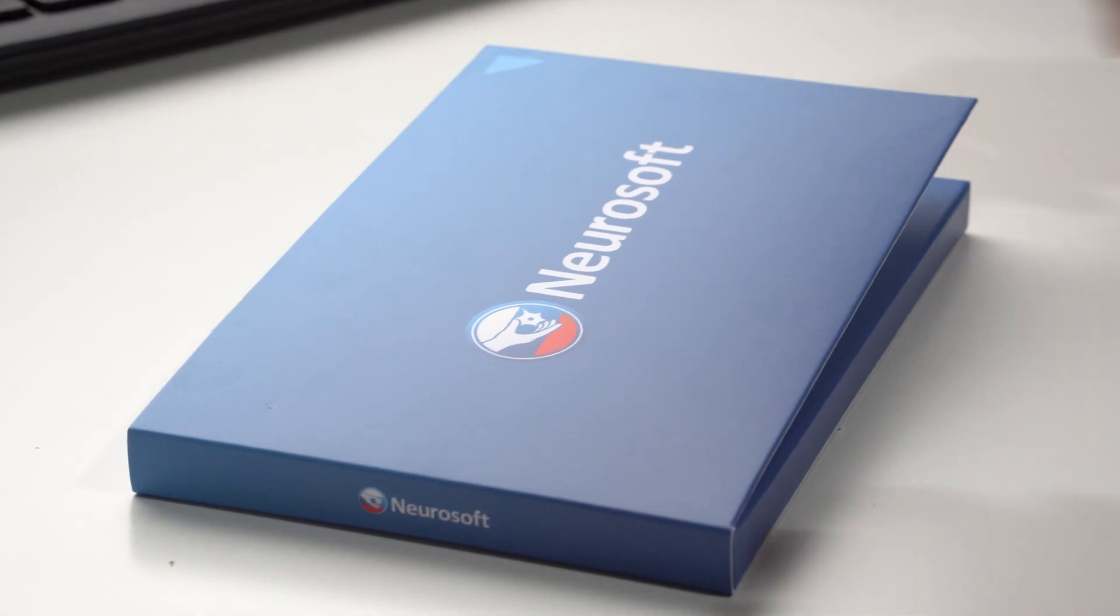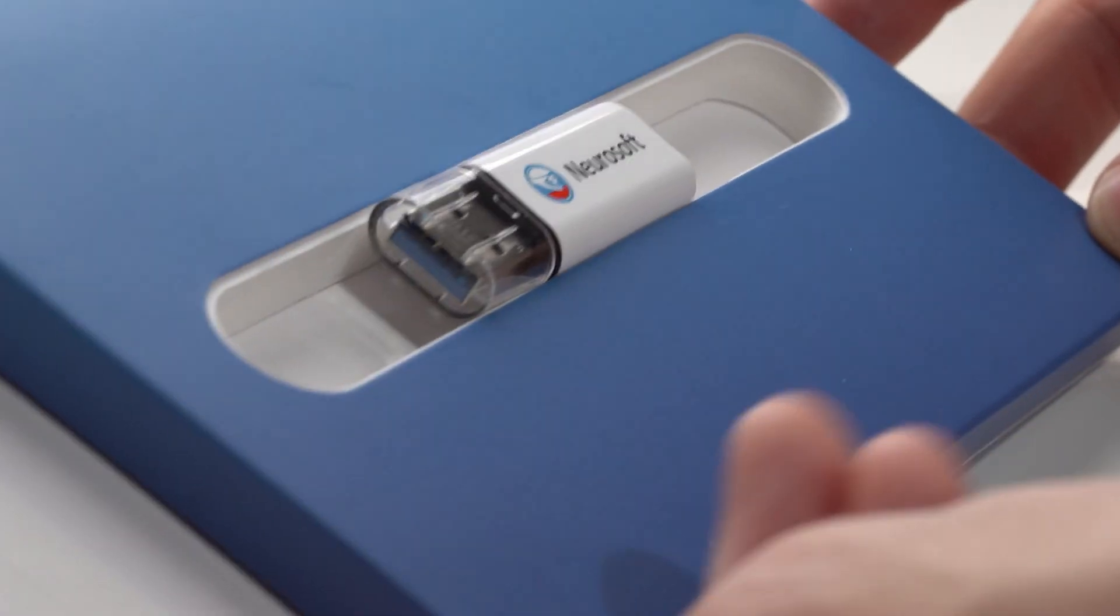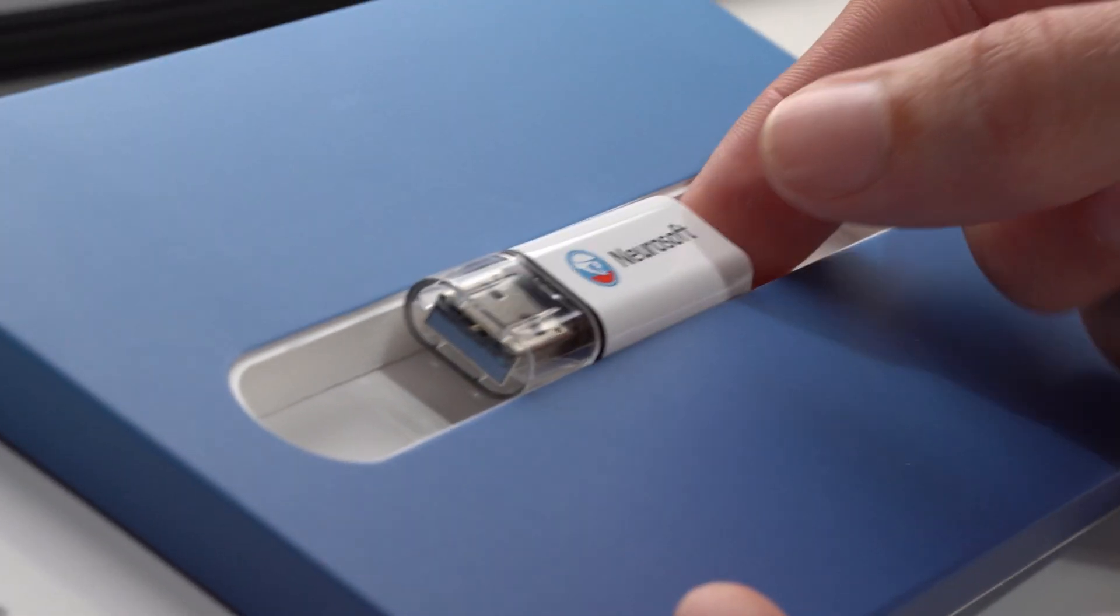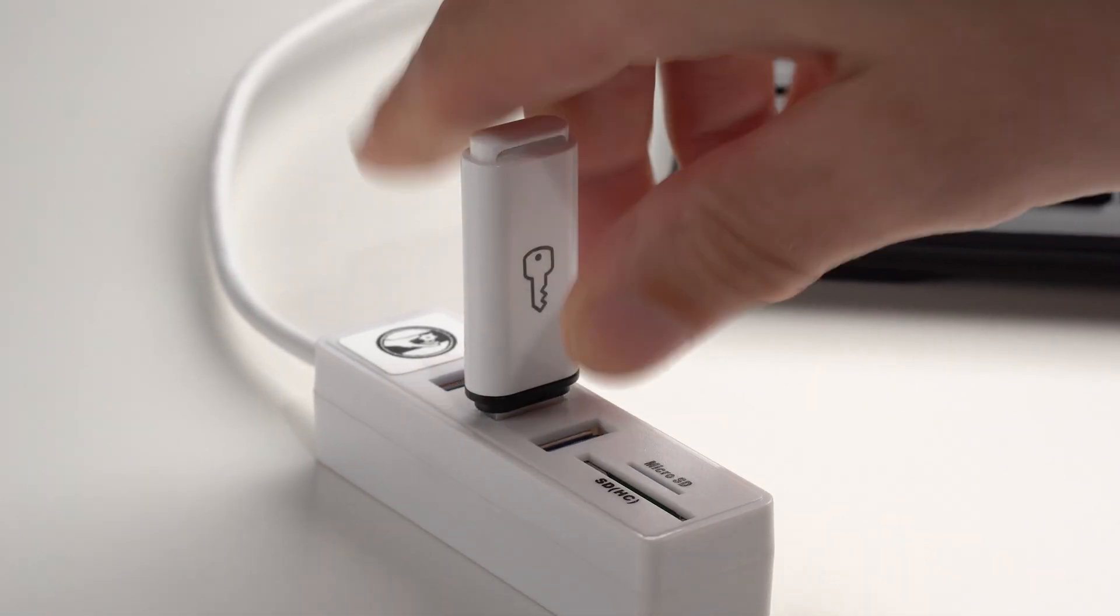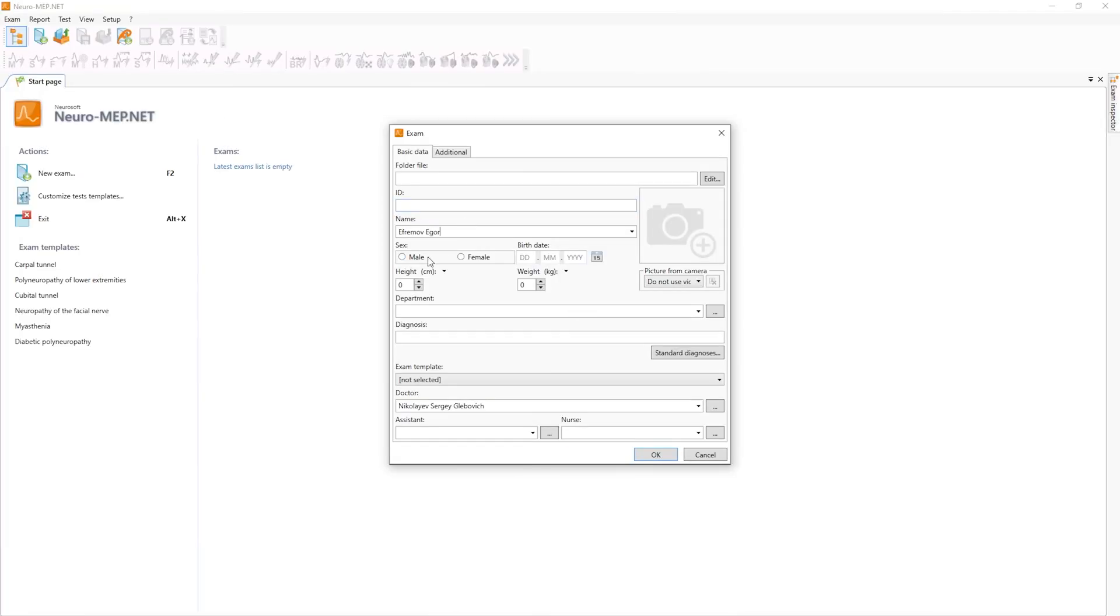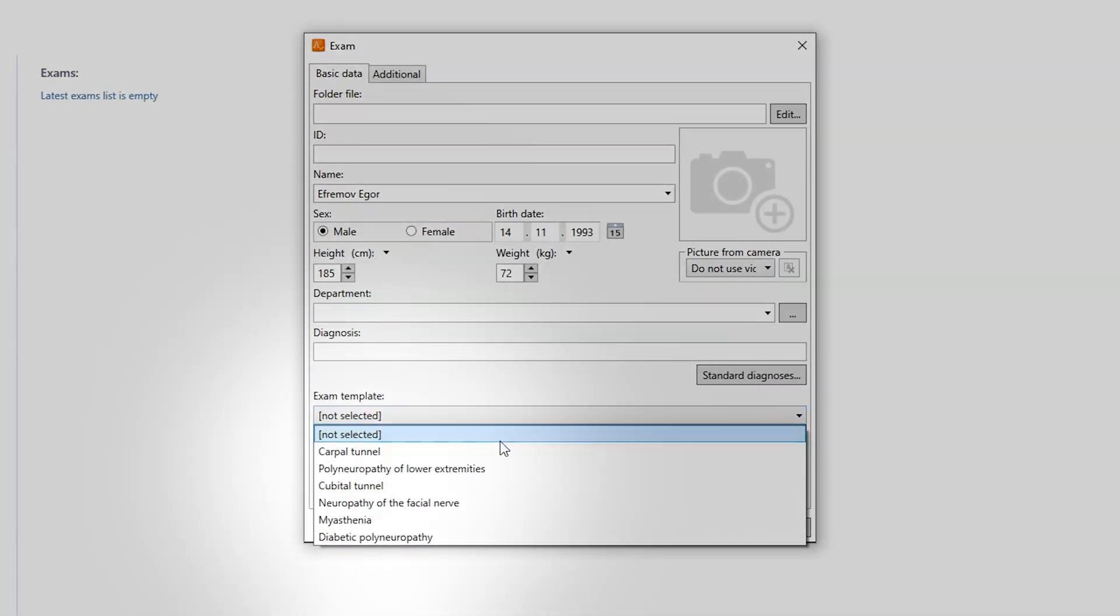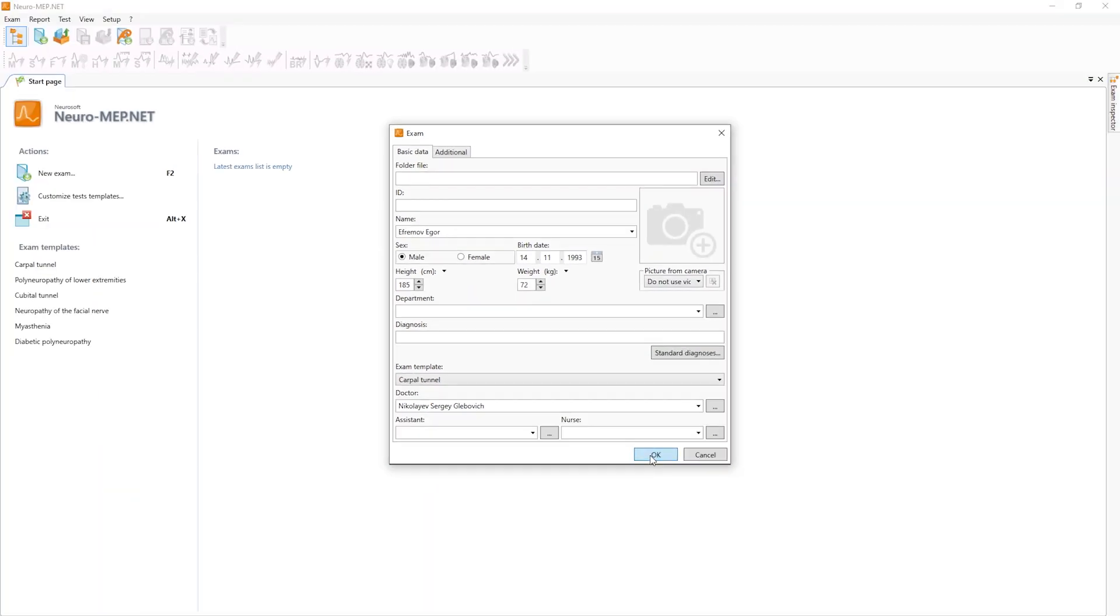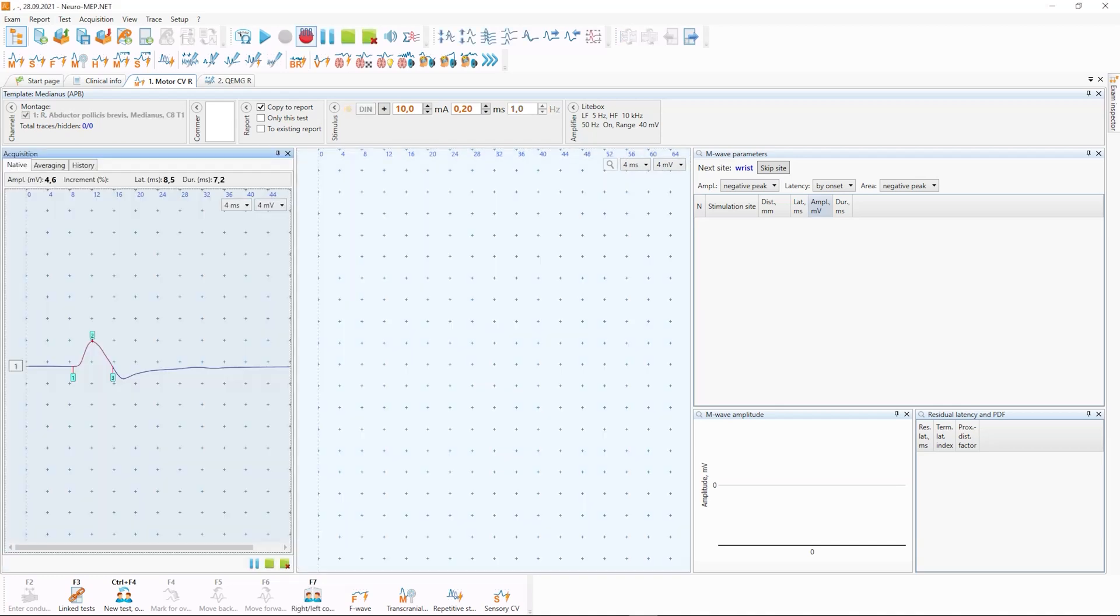The smart interface of Neuro-MEP.NET software supplied with Litebox facilitates quick yet comprehensive examination no matter how complicated it is. The software features predefined test templates for most common studies. Select the template for a particular disorder and the software will automatically start the respective test.